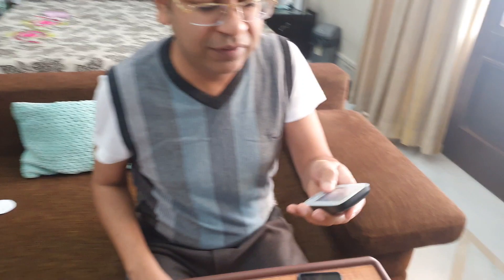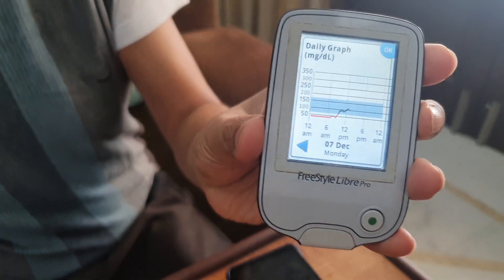In India we get the Pro/H sensor, and to get the data you need to normally scan it like this. As you can see, this is quite inconvenient.